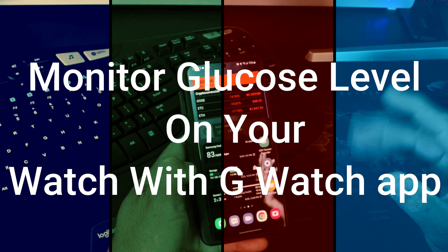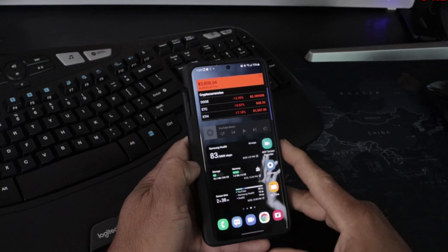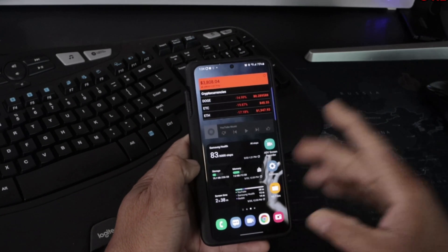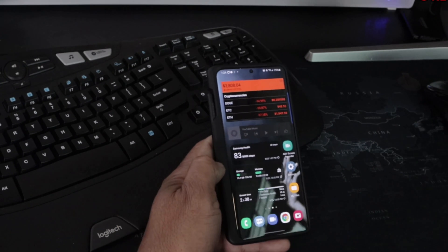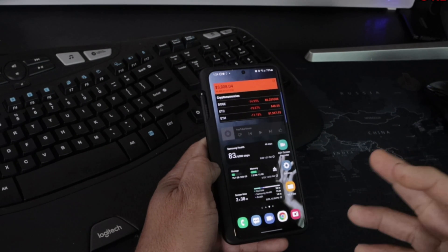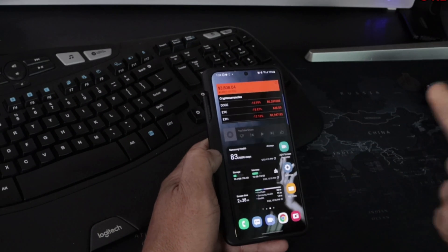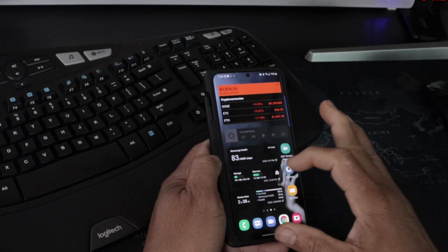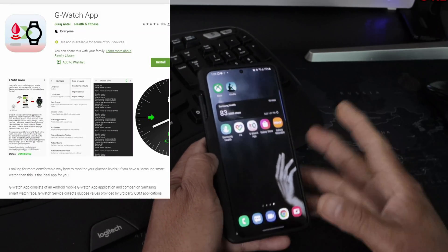Quick video today — I'm going to show you how to get the G Watch app to work on your smartphone so you can monitor your blood glucose with whatever glucose monitoring devices you may have. I have the Dexcom.